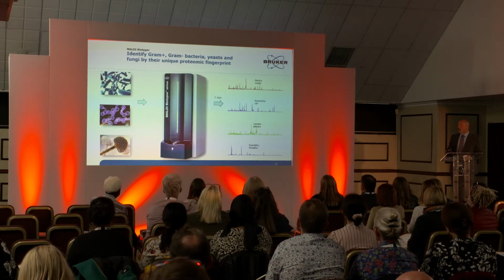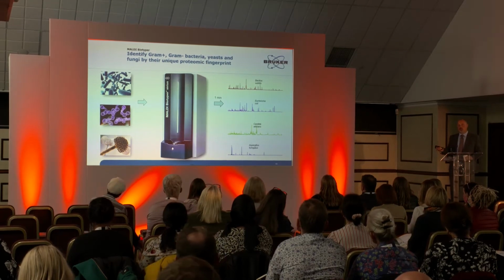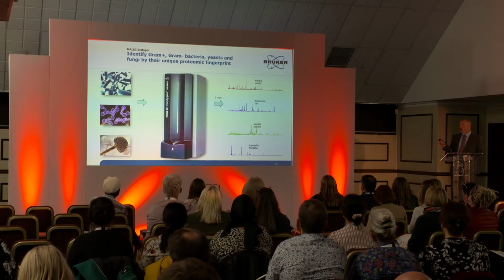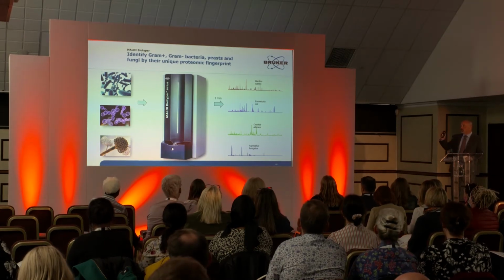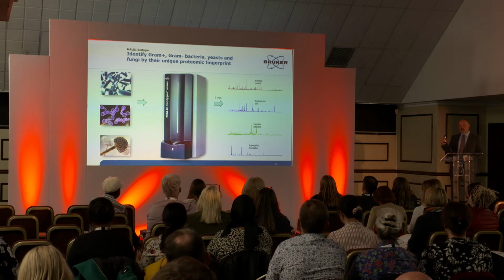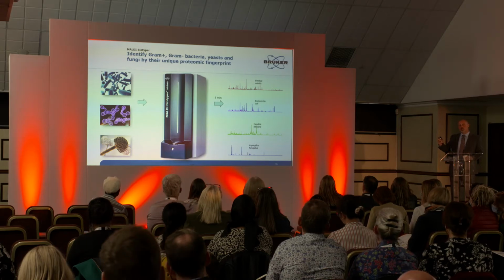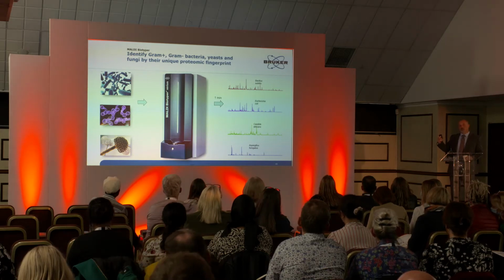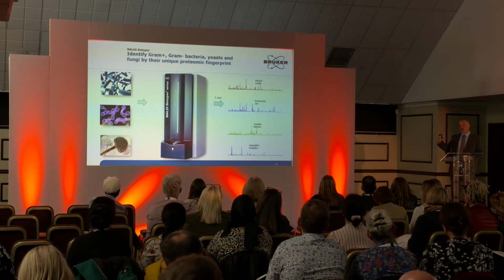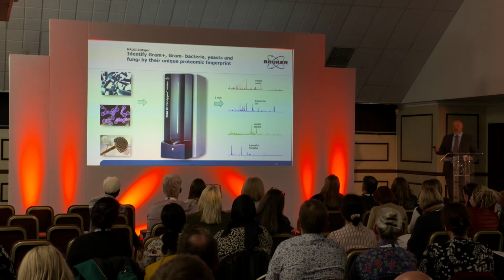So with the introduction of the MALDI Biotyper, the time to identification of the organisms was reduced really just down to 1 minute. And it employs lots of high-tech gadgetry. Essentially what you do is you put your sample onto a target plate, you fire a laser at that target, and then it is able to identify proteins from those organisms, and depending on the mass of those proteins, it gives you a fingerprint of exactly what those organisms are. So this is proteomics in action, and I think anything with a laser in must be good.